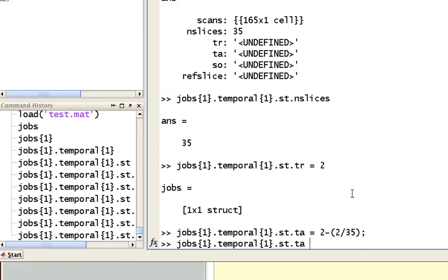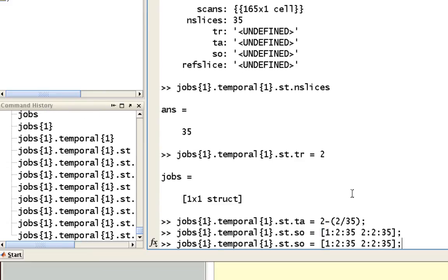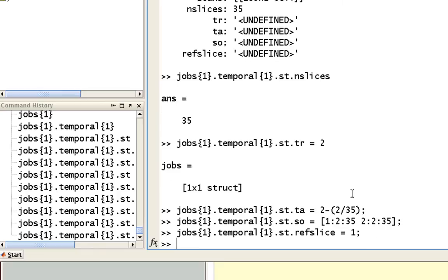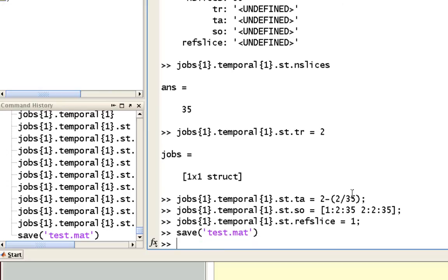And the slice order is, let's see here, if I recall correctly, this is how you should do it. Yeah. And the last field is going to be the reference slice. And I believe we'll just have that be 1. Okay. So that's it. And then you just save out this same test.mat file.